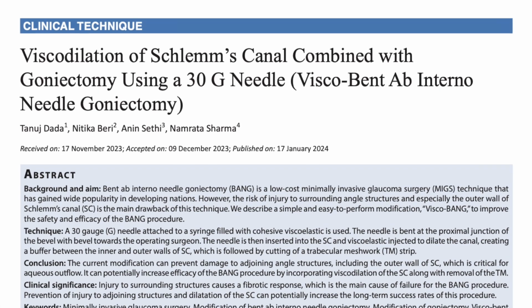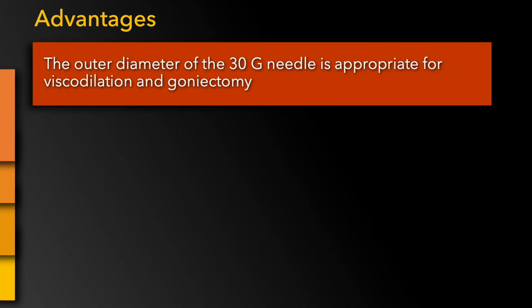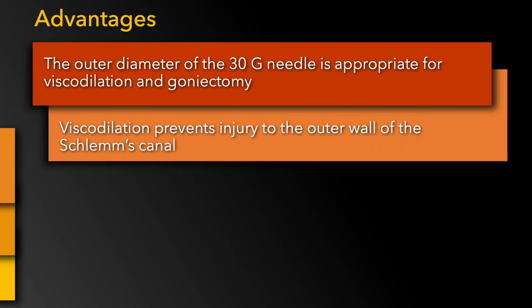This technique of Visco-BANG has been published in the Journal of Current Glaucoma Practice. The Visco-BANG procedure offers certain advantages over the conventional needle goniectomy.